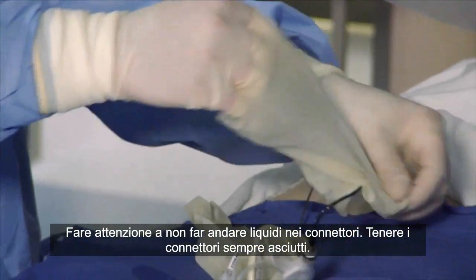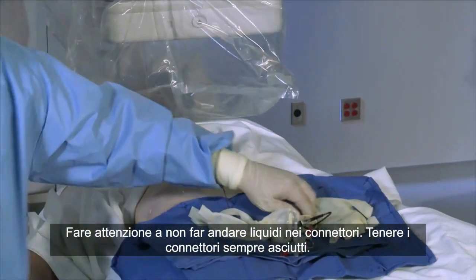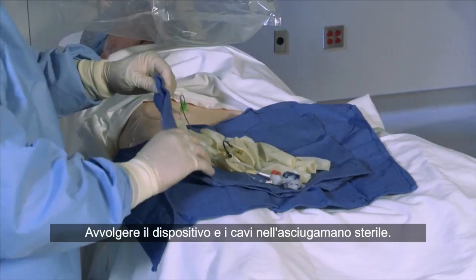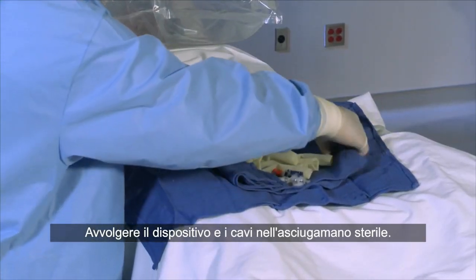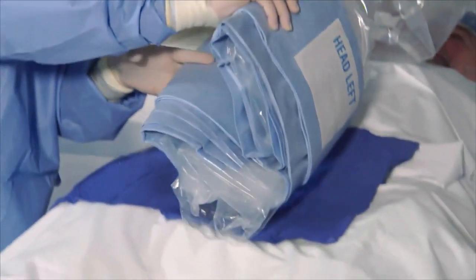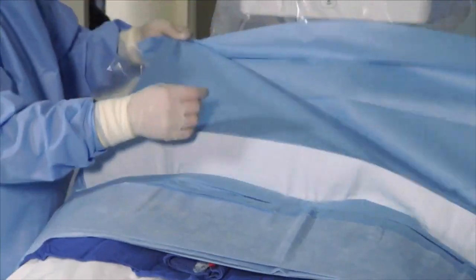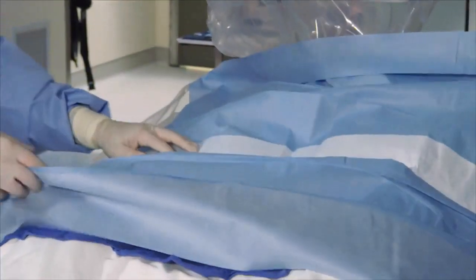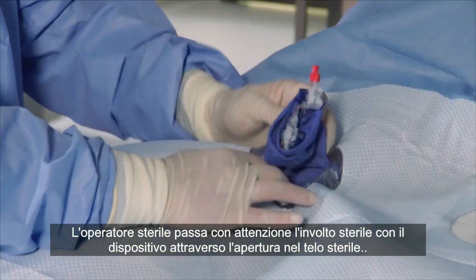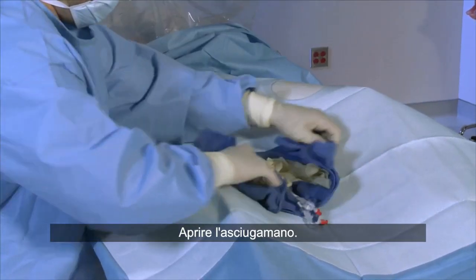Be careful not to get fluids in the connectors. Keep the connectors dry at all times. Wrap the device and cables in the sterile towel. The sterile operator carefully passes the sterile bundle with the device through the opening in the sterile drape. Unwrap the towel.